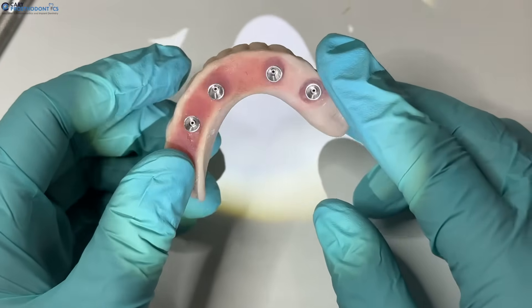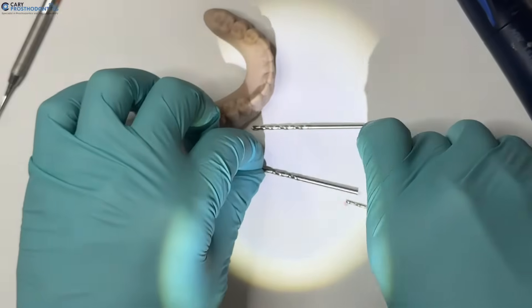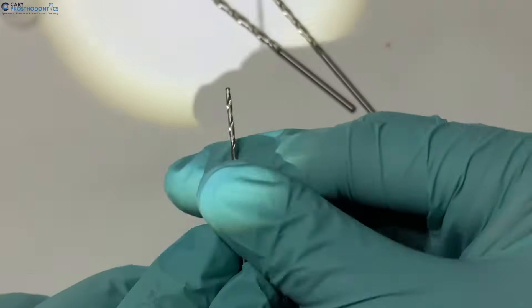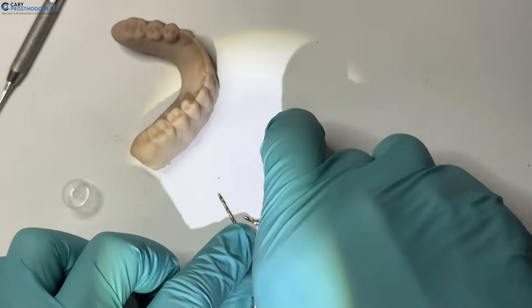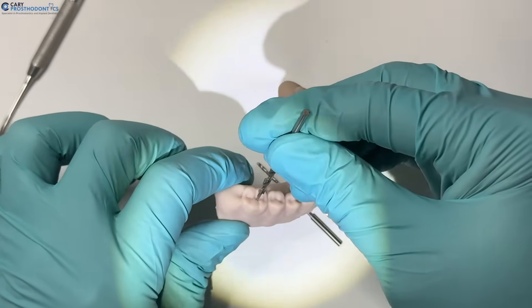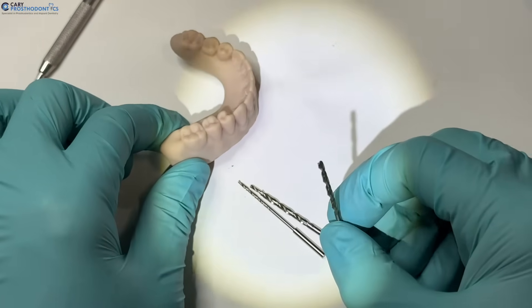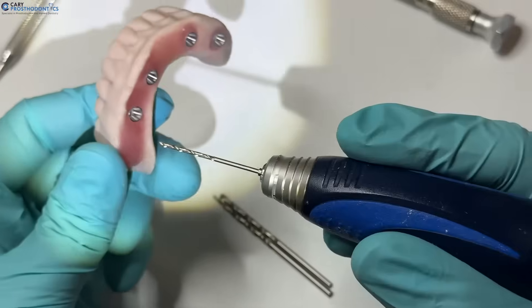Sometimes it helps to figure out where the screw access hole is coming out when doing the contours. For the smart denture, we'll have three drills. The first drill goes in from the back end — it's the skinniest. The second drill has a step to it and comes in through the occlusal to make the screw access hole. The last drill goes on a hand reamer, not a handpiece.